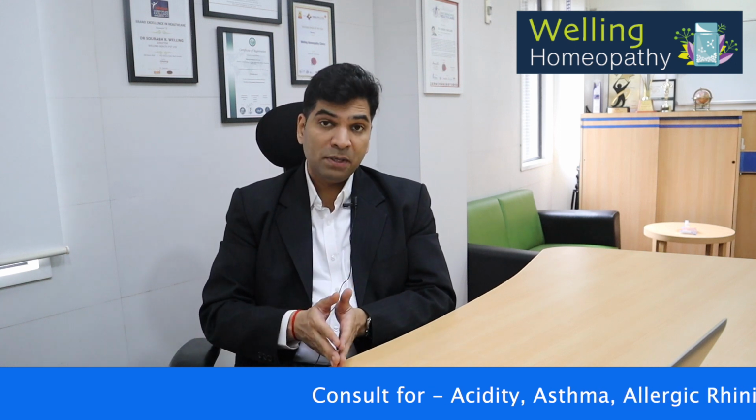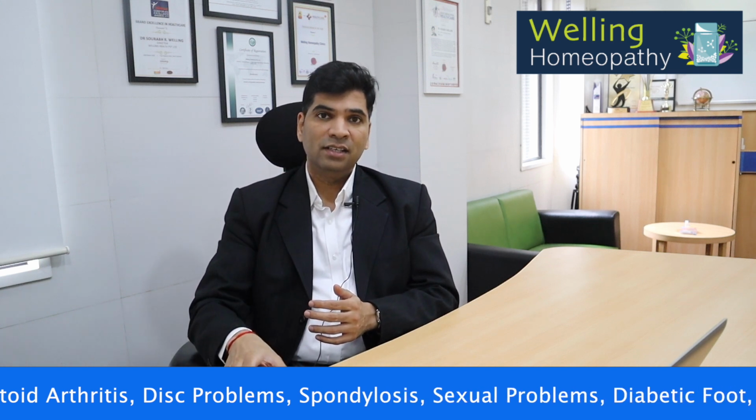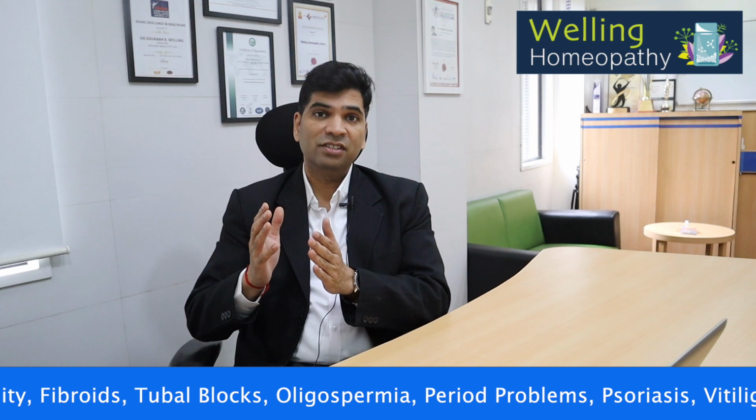However, some people have trouble reading a positive ovulation test result. If you don't get a very strong hormone surge or a hormone increase, it can be very difficult to tell whether the test line is as dark as the control line. Plus, ovulation tests may not work well for people with PCOS, as I said, who can have several hormone surges or high levels of luteinizing hormone throughout their cycles.